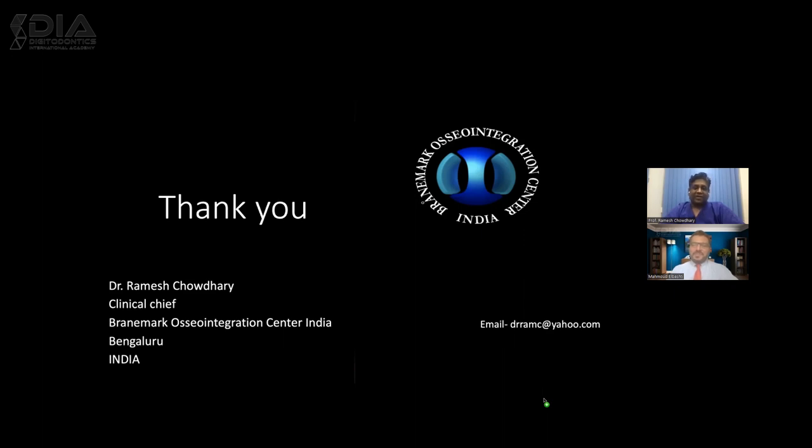Absolutely, absolutely. In two decades of my practice, I'll give you an example. When my follow-up patients come from the last 15 years and I take a CBCT now, I see that I had positioned implants very wrongly sometimes, but it was not seen. And we feel that if given an opportunity now, we would really change it. So the mentality of our positioning of implants and accuracy is increasing because there is somebody telling us that you are doing wrong, which was really not happening before.